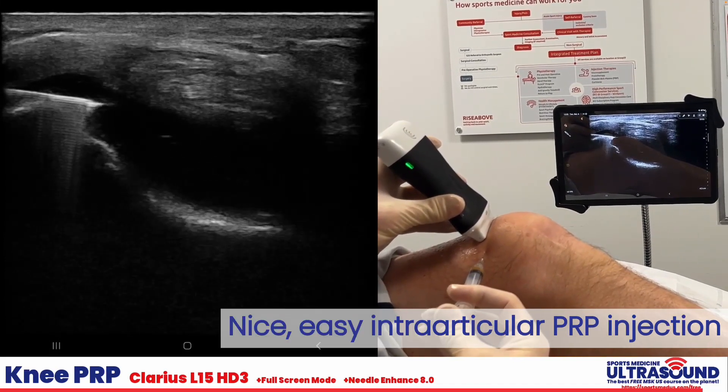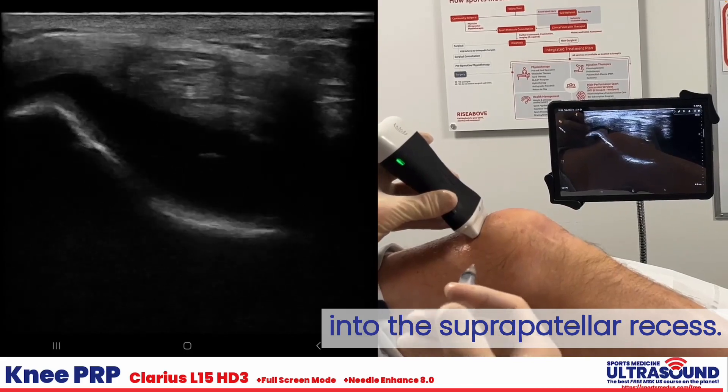And there we are — nice, easy intra-articular PRP injection into the suprapatellar recess.